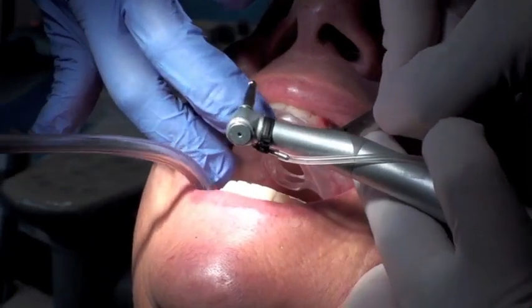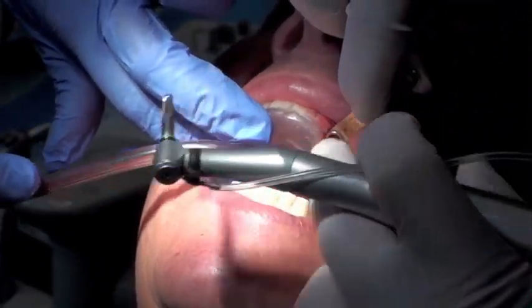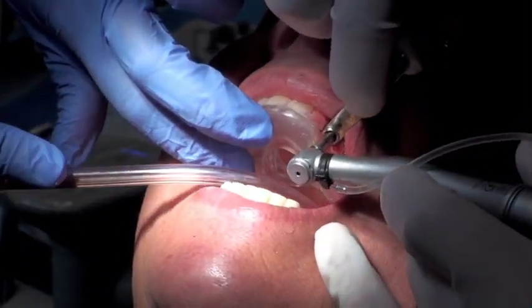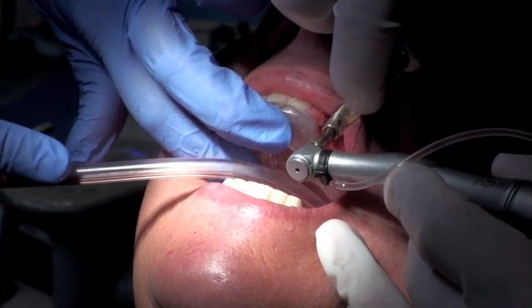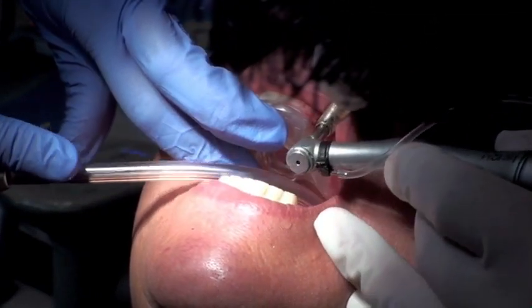In a surgery like this, there is very little room for error. In fact, because the ridge width is only 4.5 millimeters, that leaves me 0.5 millimeter on either side of the implant. Freehanding this implant would be virtually impossible.